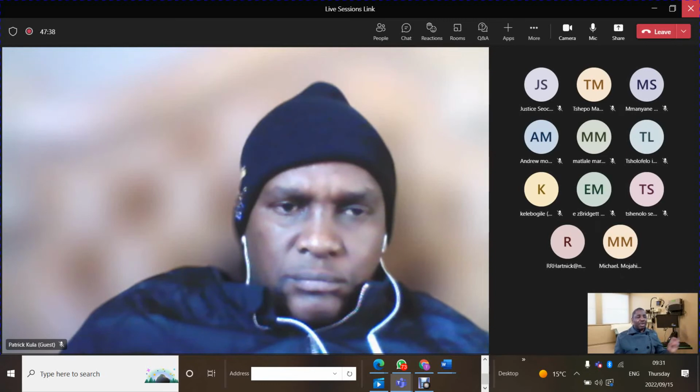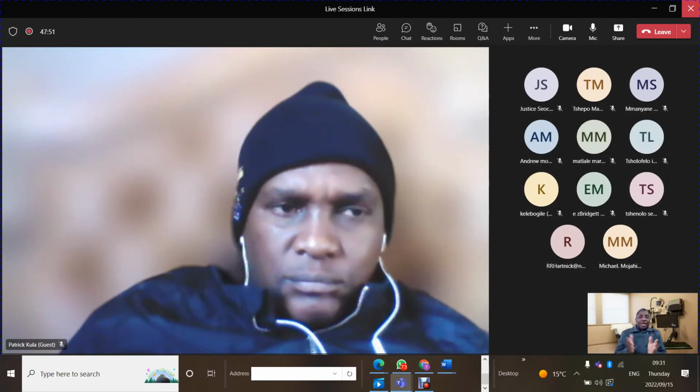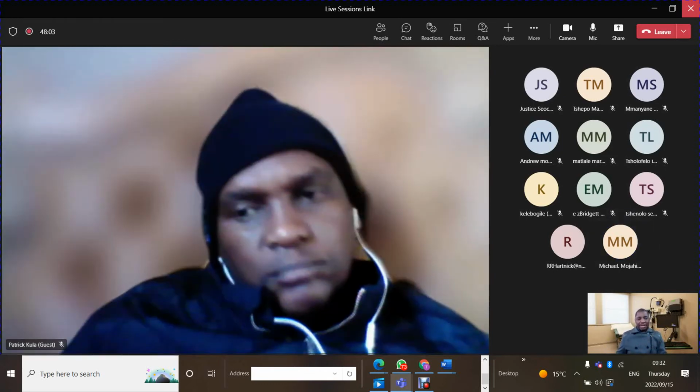So your signal could be acoustic, mechanical, whatever, and your transducer converts that into usually an electrical form. Your probes, which are your applied parts, you connect to the body, and they pick up signal. Those signals are very small and cannot easily be displayed, so they have to be amplified.